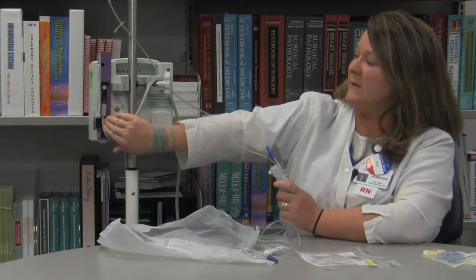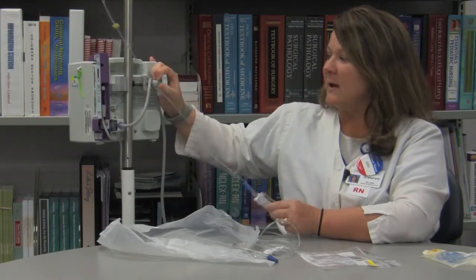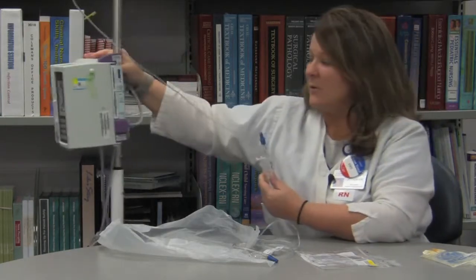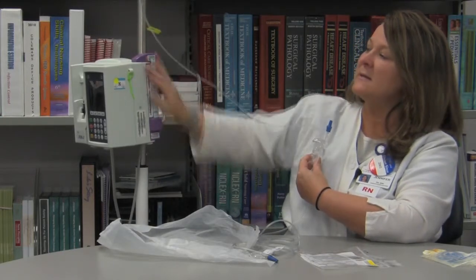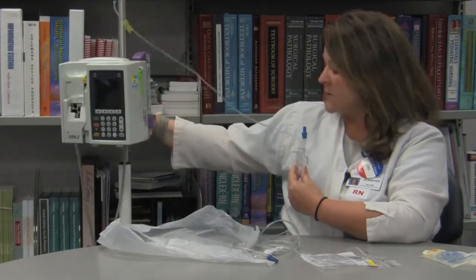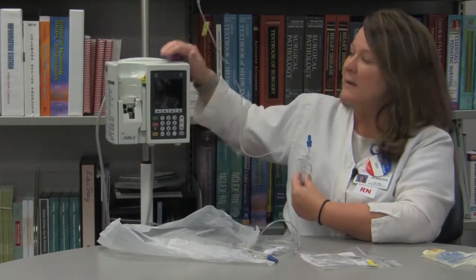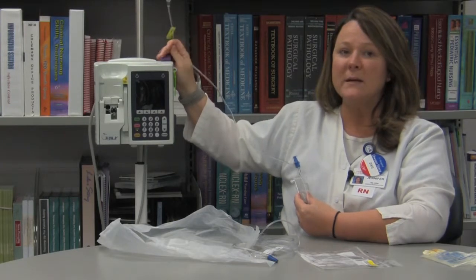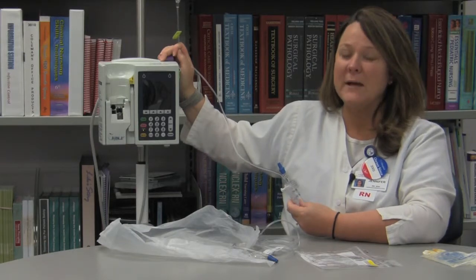This pump also has a feature down here where it will connect into the patient's call light. If we do have a patient that if their pump alarms, maybe they would not be able to turn on their call light. Okay, if you'll notice this purple piece, this pump is like a small computer. It is wireless, so that's where the software is. It has what we call safety software attached to it, which helps provide IV therapy, especially with medication in it, at a safe rate to the patient.